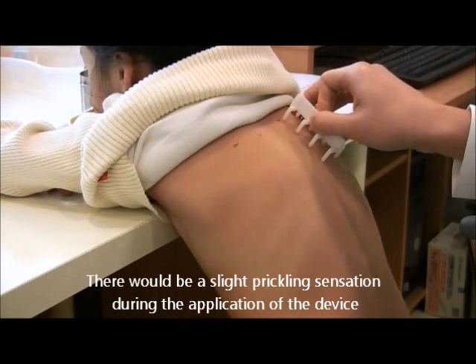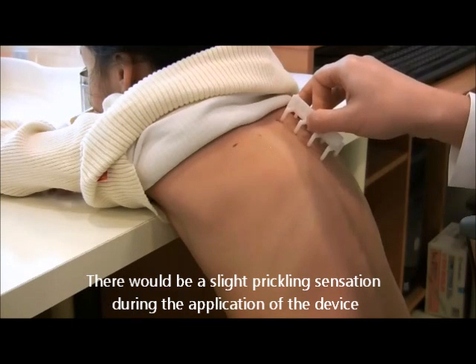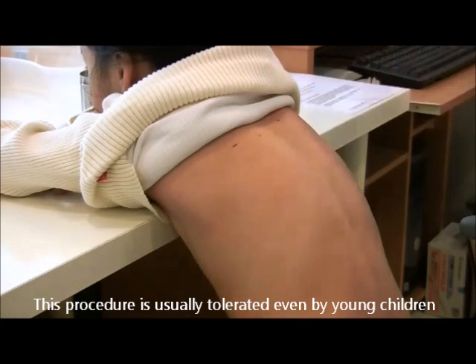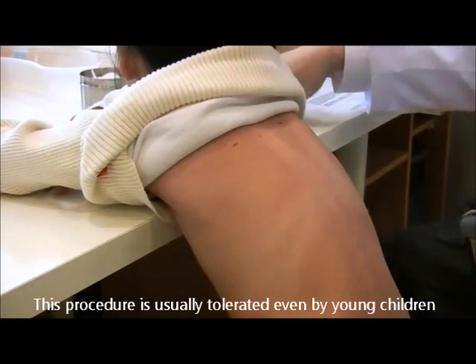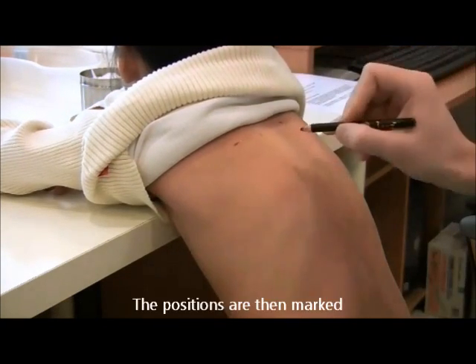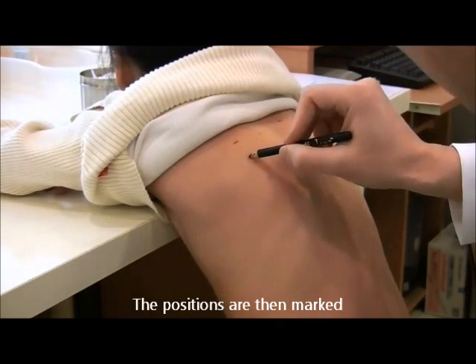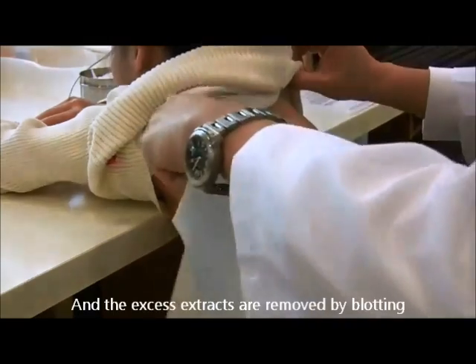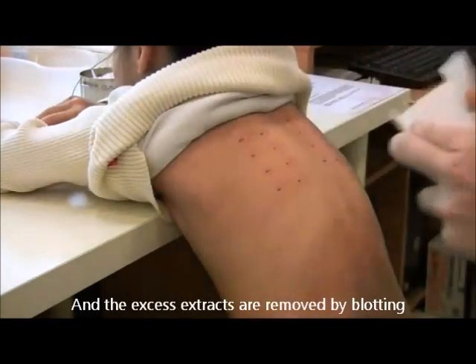There will be a slight prickling sensation during the application of the device. This procedure is usually well tolerated even by young children. The positions are then marked and the excess extract removed by blotting.